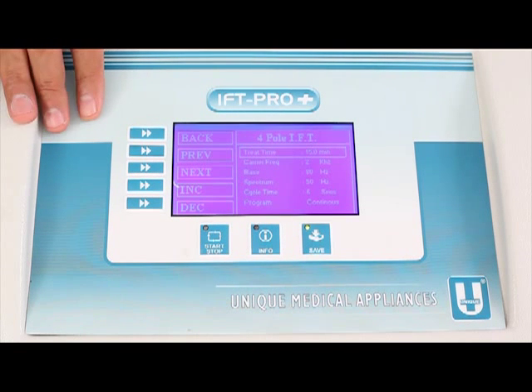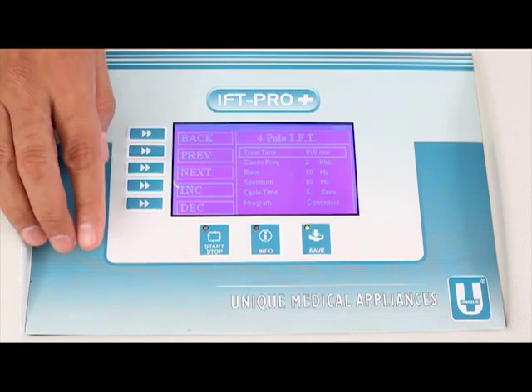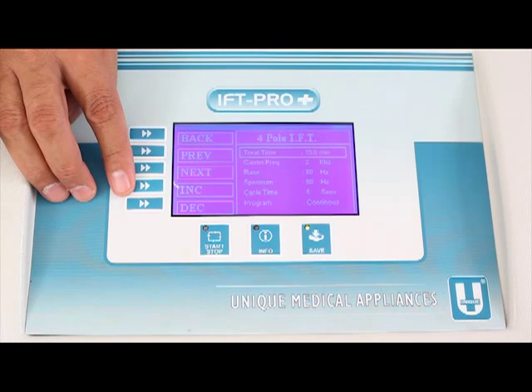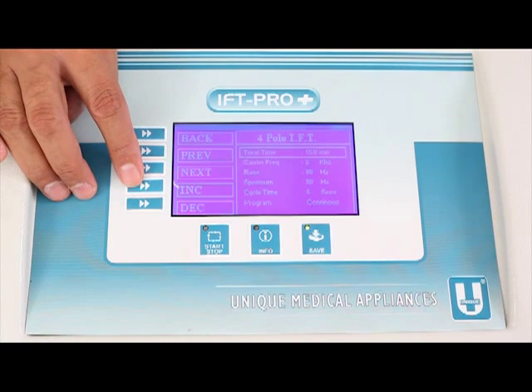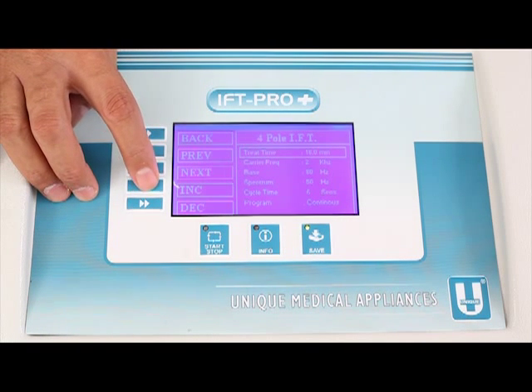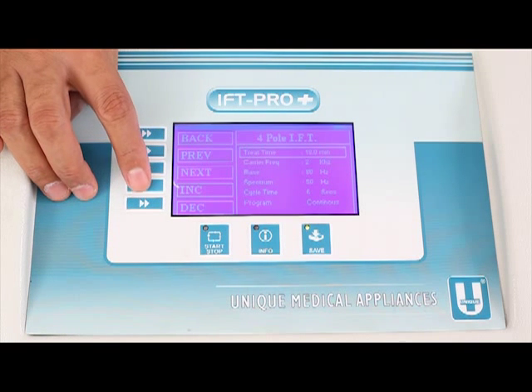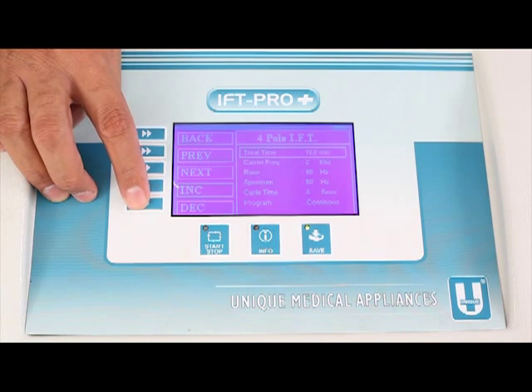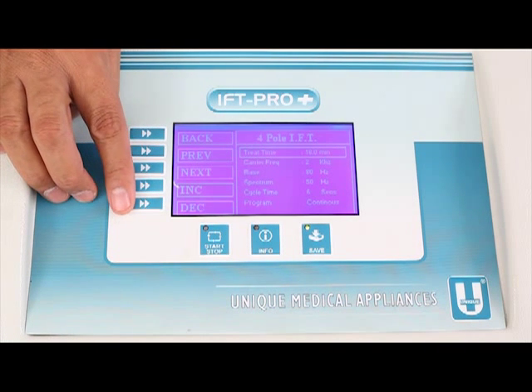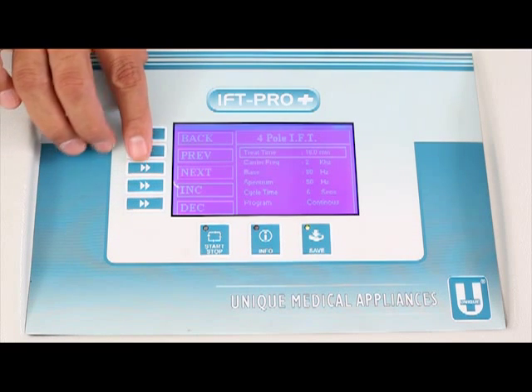The machine announced all pre-selected parameters starting from treatment time at 15 minutes. To increase or decrease treatment time, use F4 and F5. Pressing F4 increases it — treatment time 16 minutes, then 18 minutes. Pressing F5 decreases it — treatment time 17 minutes, 16 minutes. To move to the next parameter, press F3, which announces: Carrier frequency 2 kHz.